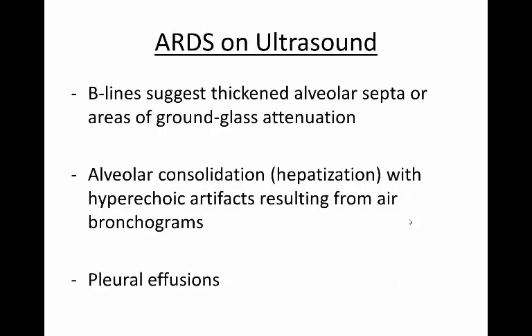With ARDS on ultrasound, there are many different lung pathologies that we can see in patients who fulfill criteria for ARDS. Beelines may suggest thickened alveolar septa, but they can also represent areas of ground glass attenuation, which you might see on a CT scan. Patients with ARDS may also demonstrate areas of alveolar consolidation, which will be seen as hepatization on ultrasound, or hyperechoic artifacts resulting from air bronchograms. Sometimes patients with ARDS may also have pleural effusions.